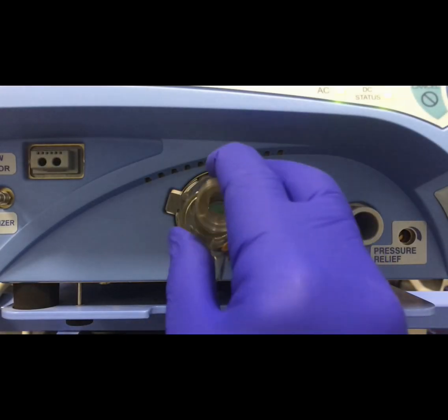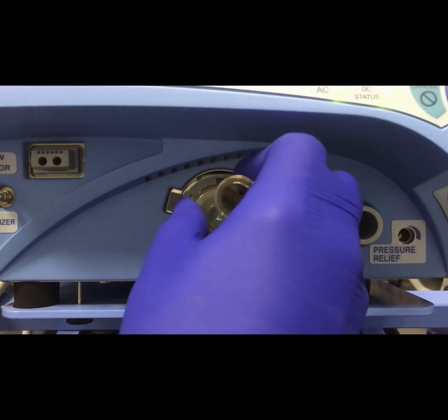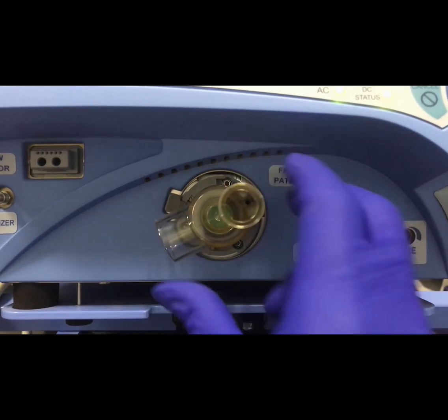Next, we'll attach the exhalation valve body by inserting it into the keyed slots and rotating it until it locks into place.